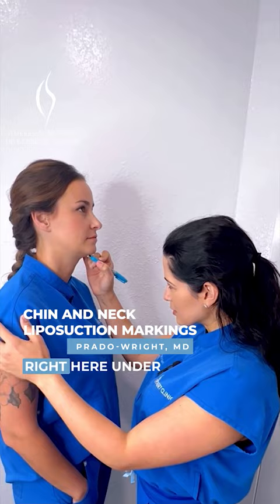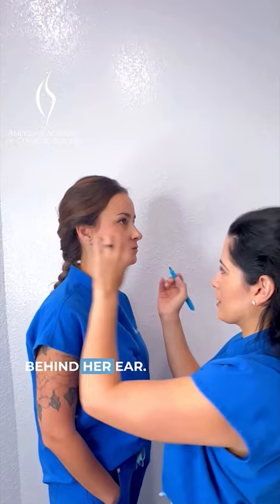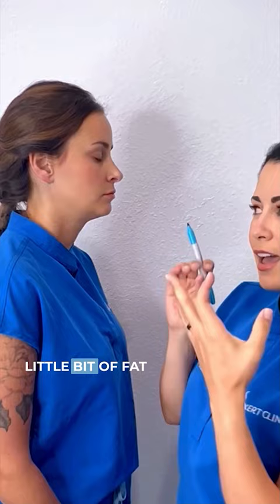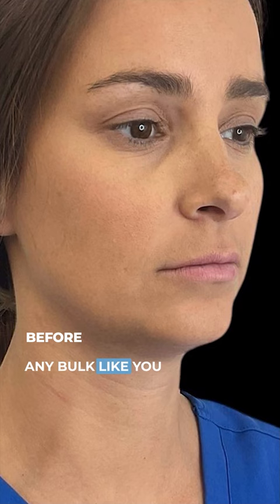We're going to be placing really hidden little entry points right here under her chin — nobody will ever see that — and behind her ear. These heal super well and don't have to be closed with stitches. She doesn't have a large amount of fat, just a little bit of fat and some skin. Between removing that fat, defining her jawline, and doing the Renew Beyond skin tightening, she's going to have a really snatched look to her jawline without adding any bulk like you would see with jawline filler.